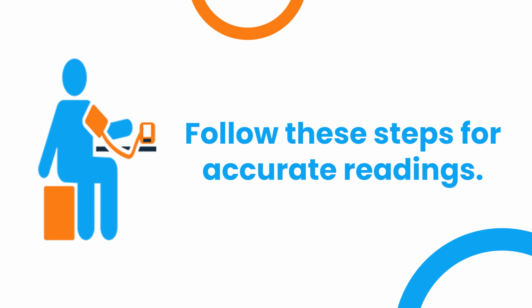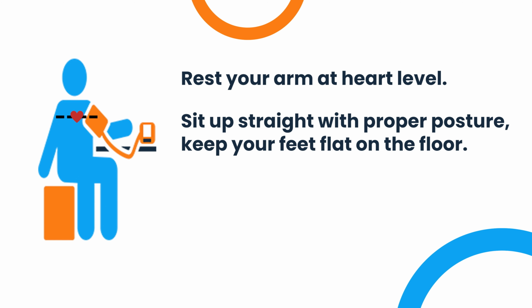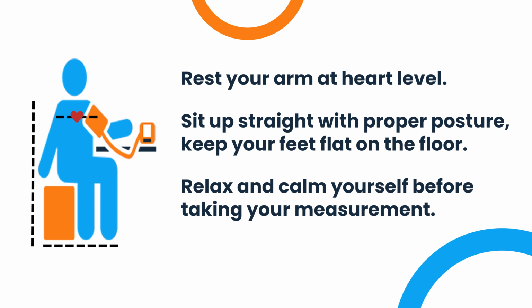To ensure the most accurate readings, it is important to follow these steps for optimal conditions. First, rest your arm at heart level. Next, sit up straight with proper posture. Make sure to keep your feet flat on the floor. Lastly, take a few minutes to relax and calm yourself before proceeding with the reading.